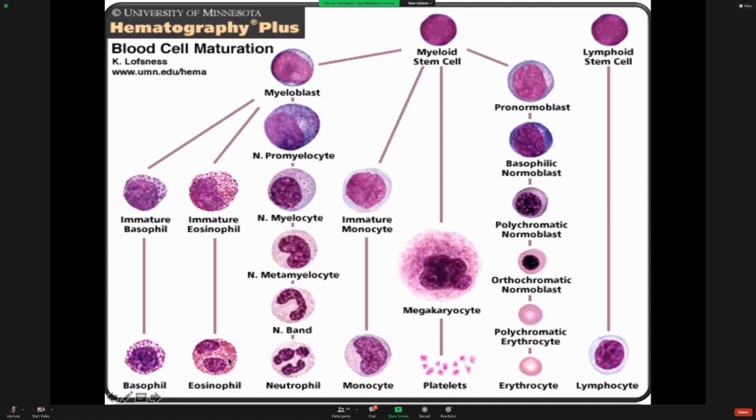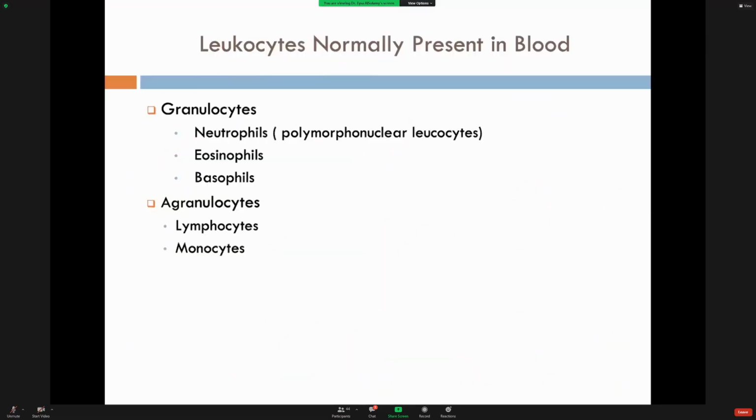الإيزينوفيل you can see it, it's like orange cytoplasm. البيزوفيل usually it's a black purple colors. This is how it looks like platelets with erythrocytes. This is a lymphocyte. Lymphocyte, the shape is closer to the monocyte, but usually the monocyte nucleus is larger, usually it's eccentric. هنا centric nucleus, هنا eccentric nucleus.